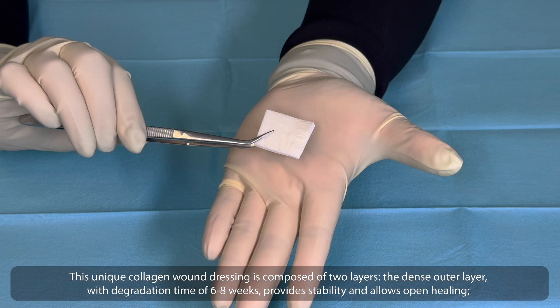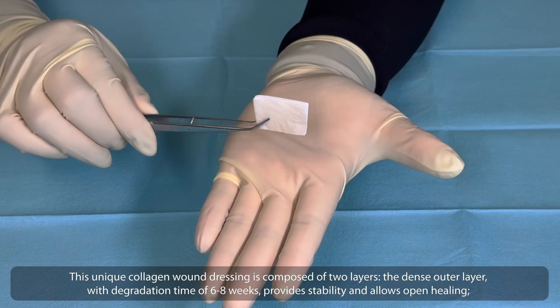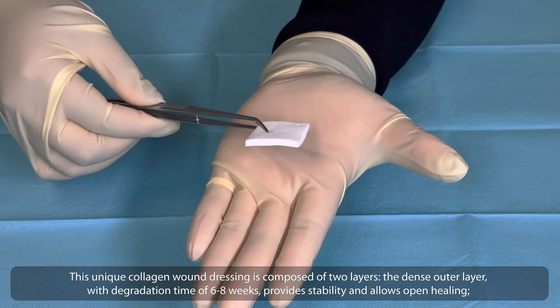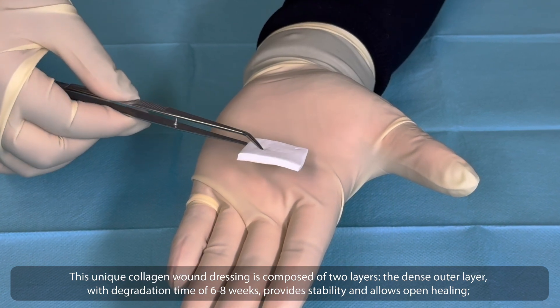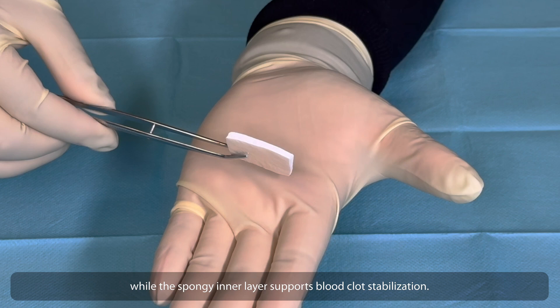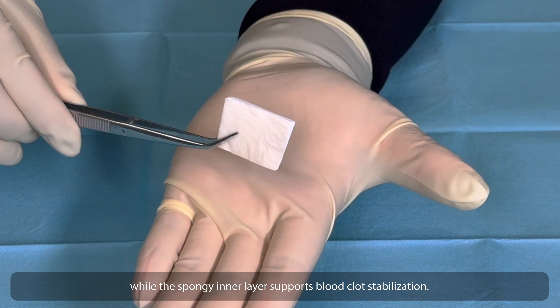This unique collagen wound dressing is composed of two layers. The dense outer layer, with a degradation time of 6 to 8 weeks, provides stability and allows open healing, while the spongy inner layer supports blood clot stabilization.